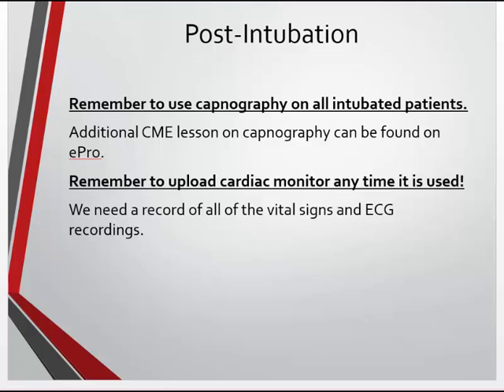For post-intubation, a couple things that I just want to mention because they're important. Remember to use the capnography. You got to use it. It's required by protocol, and it's just the best way for us to know that we're in the trachea and that your tube is still intact. And if you have not watched, again, the capnography video in that module, I would suggest to please do that. It's actually a lot of good information in there, and you want to check that out.